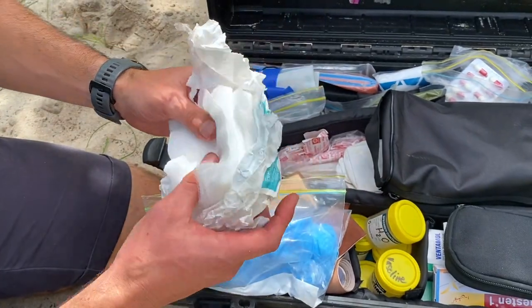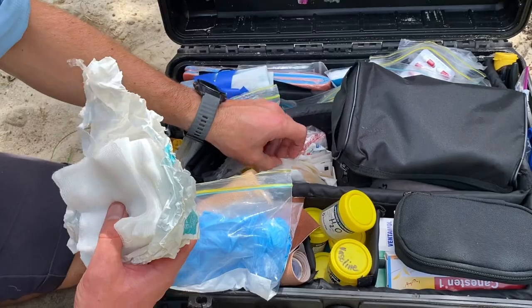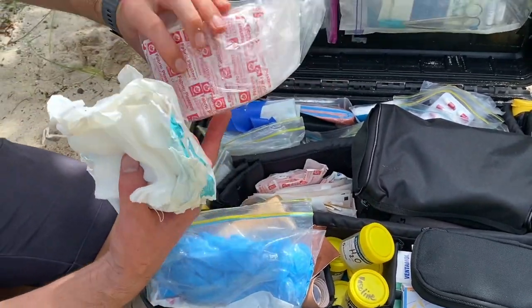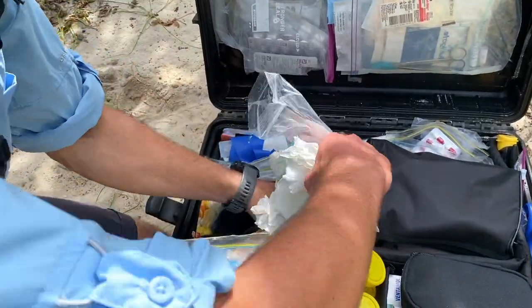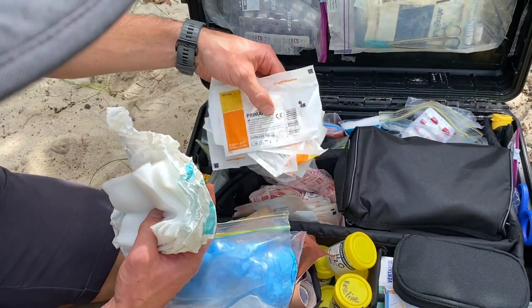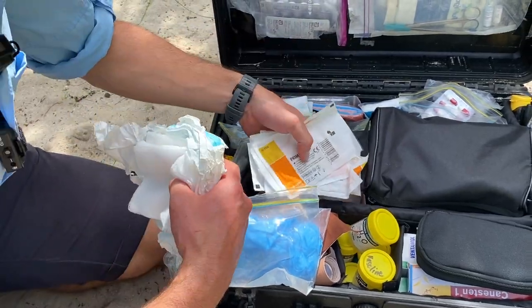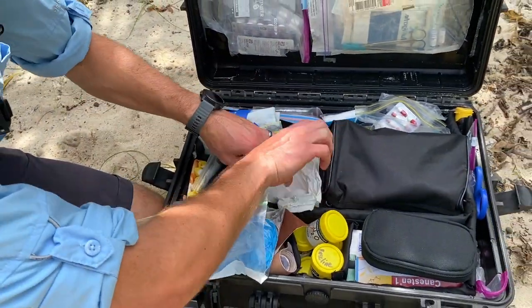That's the wound-cleaning part, and then over here I've got some non-sterile gauze — really useful for mopping wounds up and cleaning generally. Then in terms of dressings, you can never be without the humble band-aid or plaster; you get through a lot of those. We've also got some slightly larger dressings — these are Primapores in different sizes. They're just big band-aids essentially and they're really good. So that's wound care.